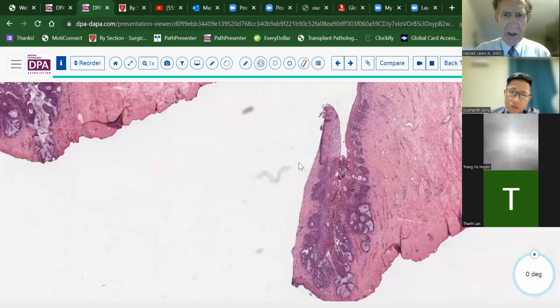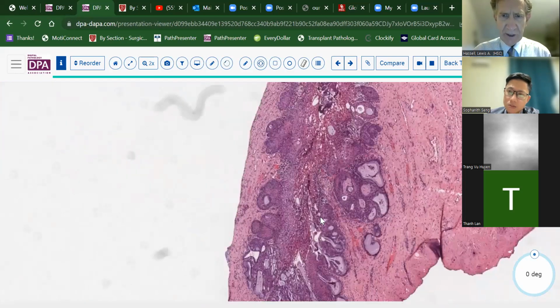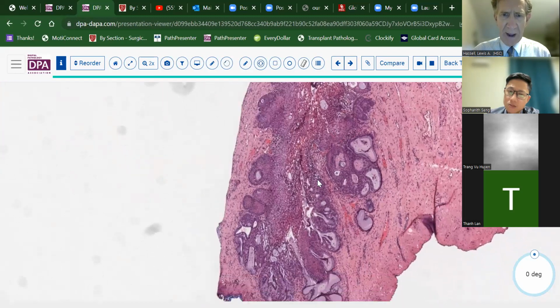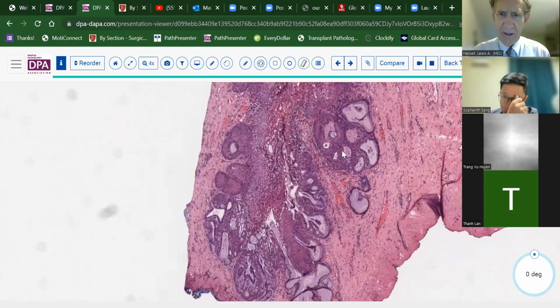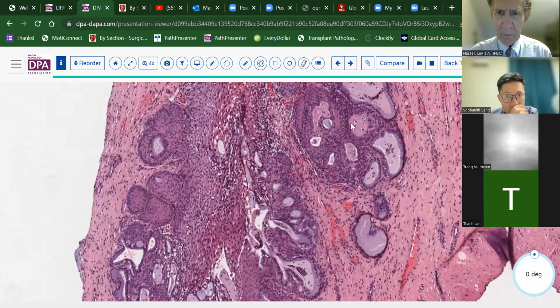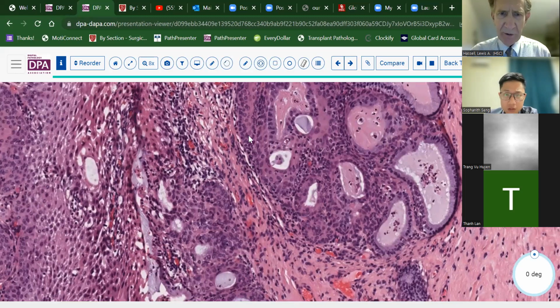So we didn't see anything in that really looked too much like dysplasia or high-grade SIL. We'll look at this area here. And again, the pattern here starts to look fairly similar. We've got glands and we have this metaplastic type of epithelium surrounding some of these glands.